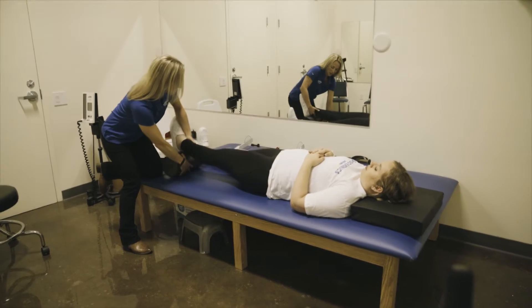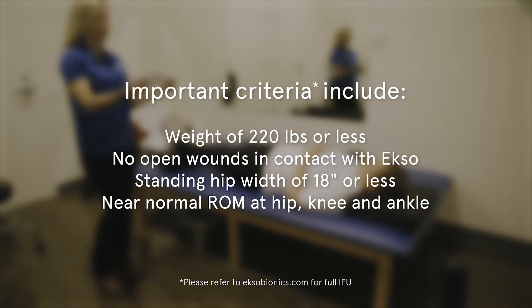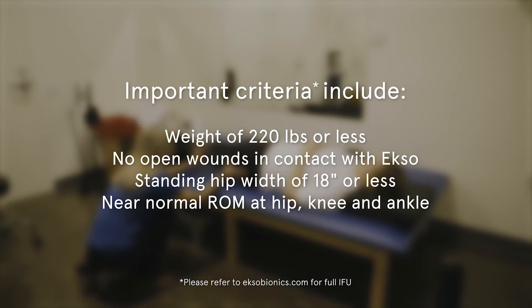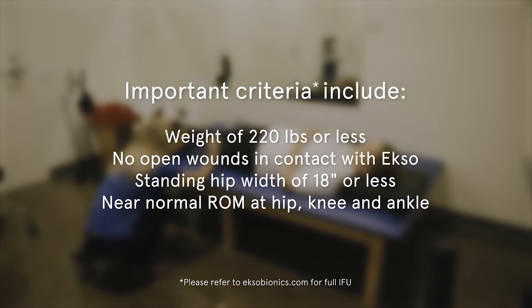Important criteria include, but are not limited to, weighing 220 pounds or less, having no open wounds in contact with EXO, having a standing hip width of 18 inches or less, and having a near-normal range of motion at the hip, knee, and ankle.